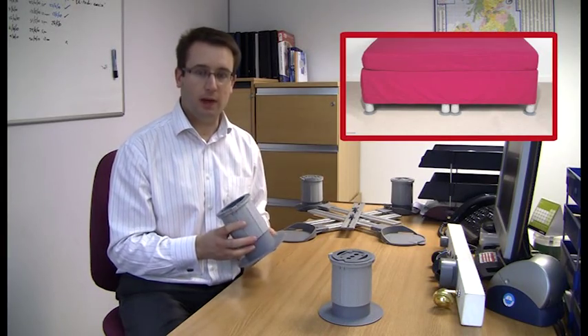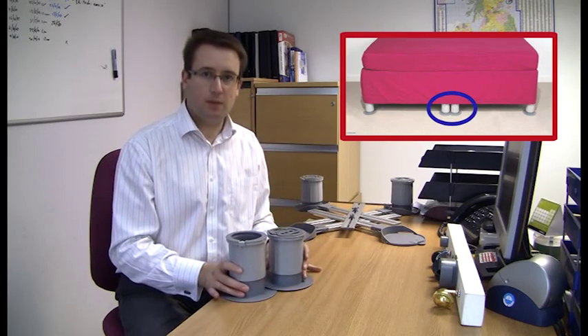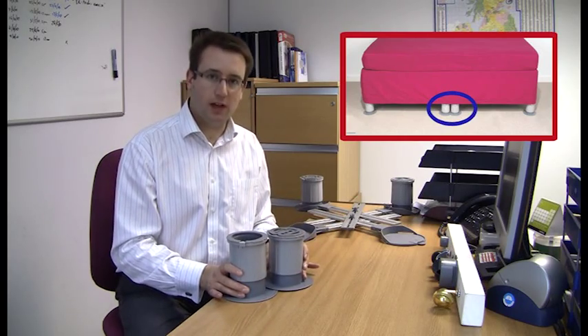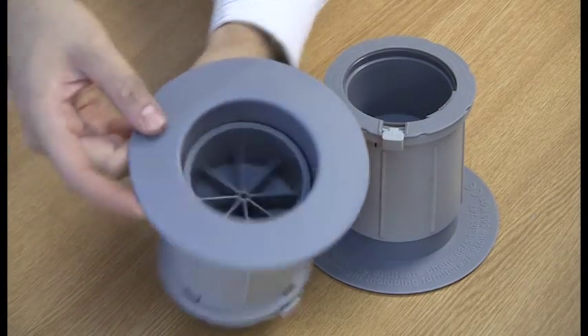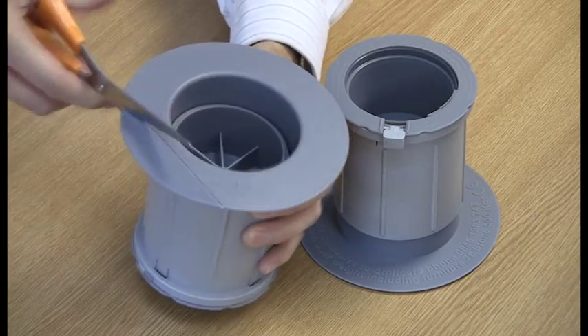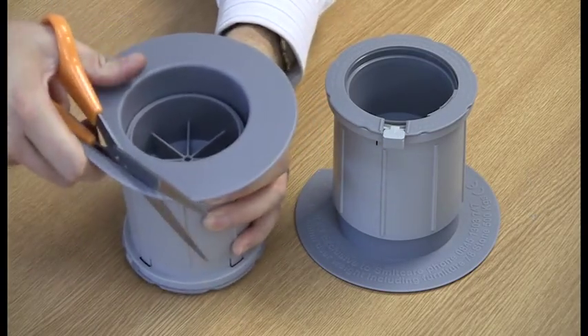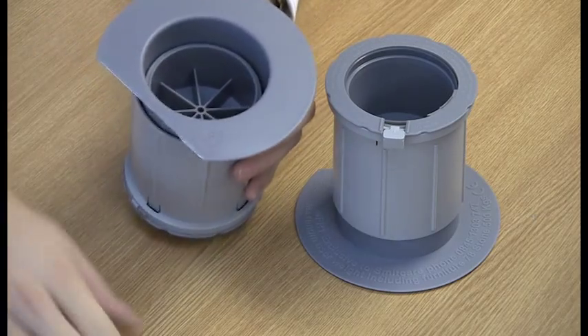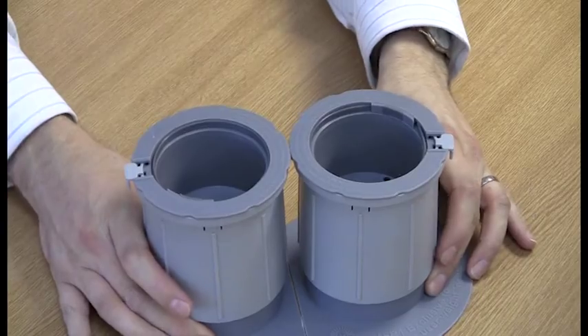If you have a double boxed divan bed which has eight casters on the bottom, quite often you need to have the furniture raisers quite close together. The Medici furniture raiser has a score line on the underside which you can either fold and break, or you can cut with a pair of scissors, discard the extra piece, and then put two raisers closer together.